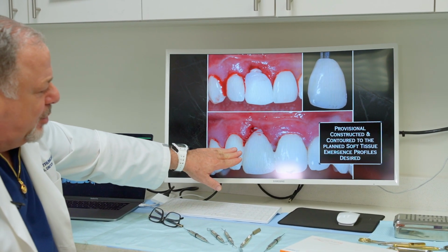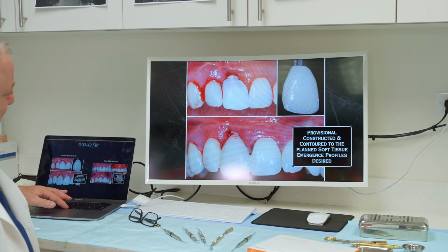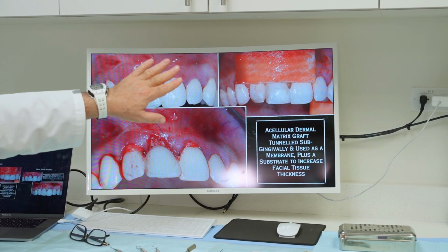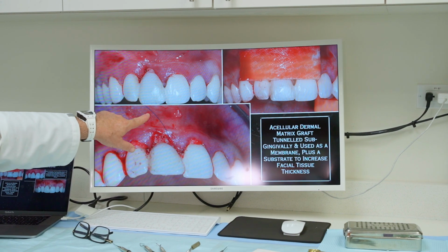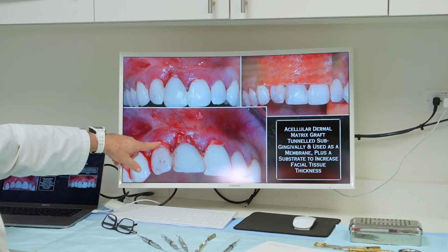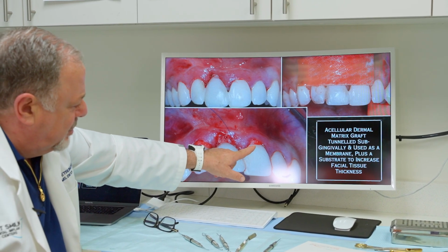But now we're going to do our bone and tissue grafting. After our provisional is placed, here's our dermis. We've rehydrated it with our PRF complex, and we're using 6-0 polypropylene, which is the blue suture. Our dermis will be placed into that pouch on the buccal, which you can see. Here's the dermis, and it goes across the whole front here. And then what I'm doing here is the dermis, you see here too, in here.